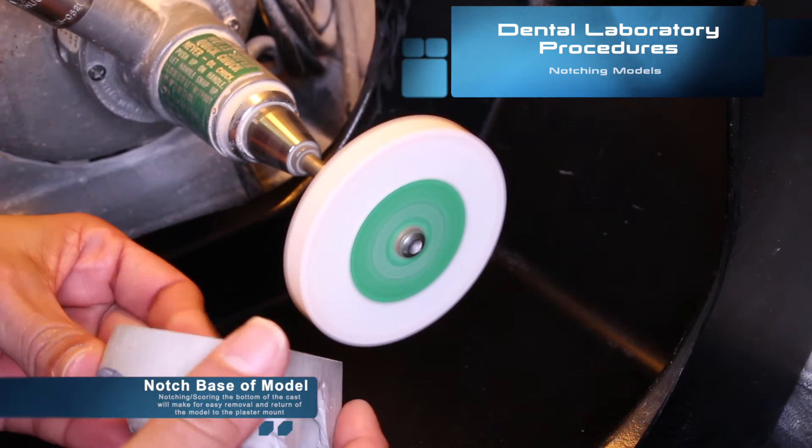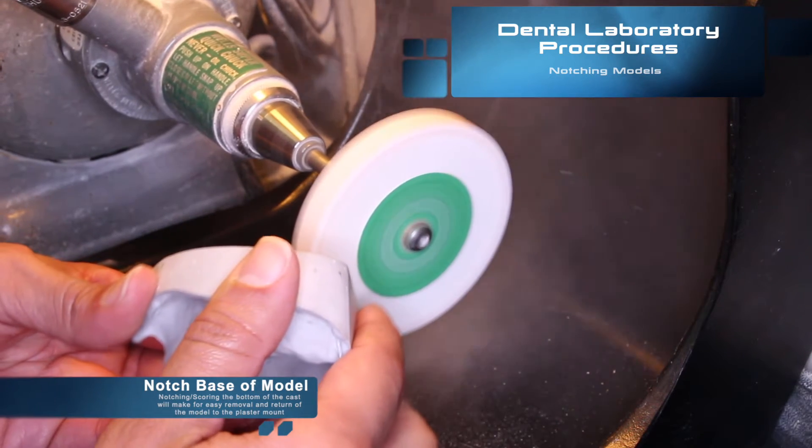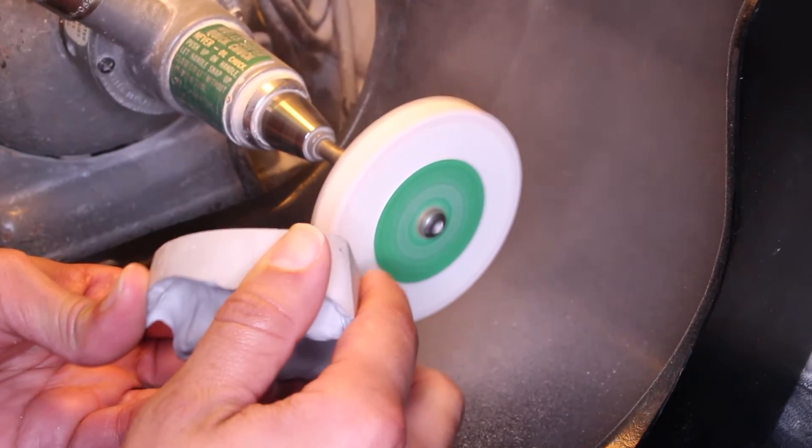The first step of articulation is to notch the base of our models. Notching or scoring the bottom of the cast will make it easy for removal and return of the model to the plaster mounts once the case is articulated.